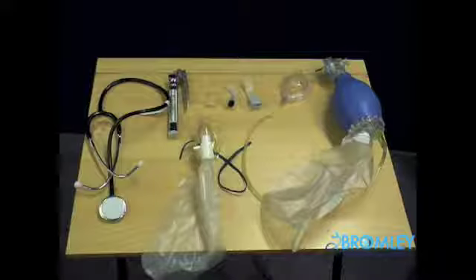This video will revise the initial assessment of an airway, the utilisation of airway manoeuvres, the utilisation of airway adjuncts, and then the ability to take over ventilation using a bag valve mask until a definitive airway can be achieved. Take a moment to familiarise yourself with the equipment and to think about the anatomical differences between an infant, a child, and the adult airway.